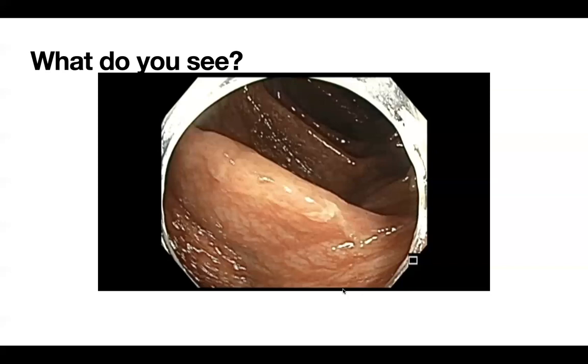So I said, okay, if I ask the anesthesiologist to paralyze and keep a low tidal volume, I can actually have a stable operating field for better resection. So that's what I did. Thank you.